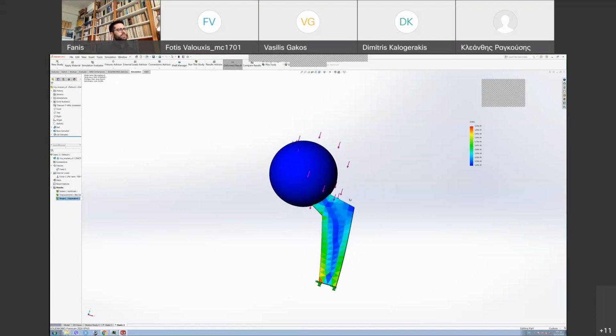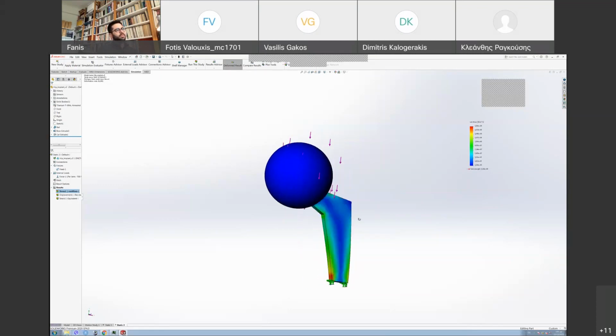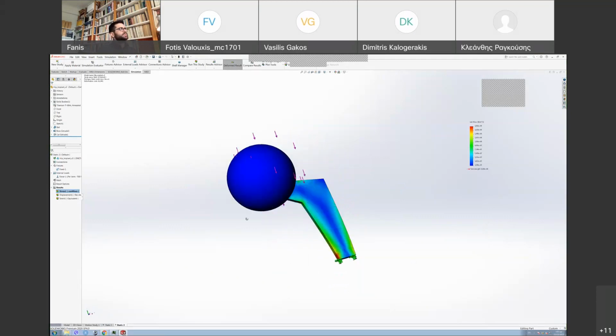But what you can also check is for materials like titanium alloys that have a very specific fatigue strength. You can check here if the stress, rather the maximum stress, is above or below the fatigue stress of the material. So for example, here for one loading, it will definitely have no problem. As we can see, we're not even close to the yield strength of this material, but for repeated loadings for 5 million cycles, it's interesting to see if it can withstand or if it can't. So this is pretty much it.